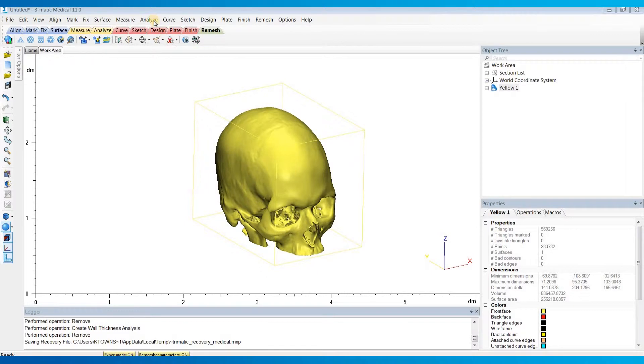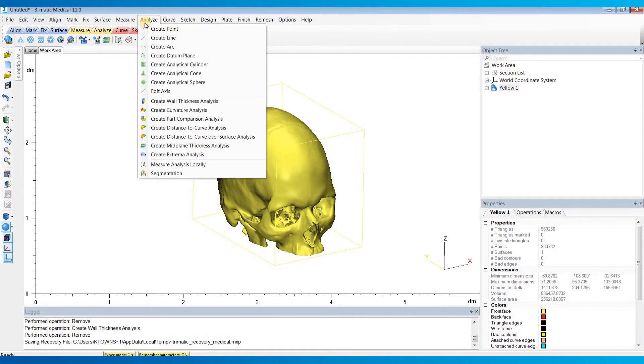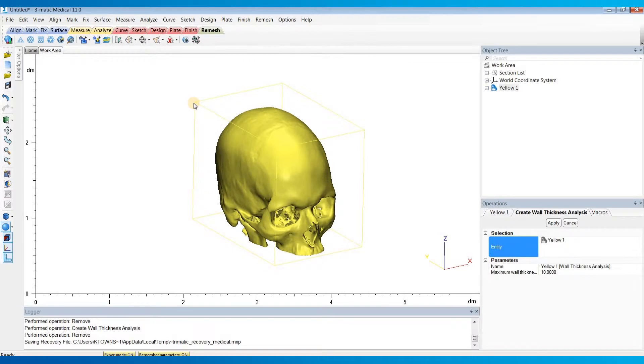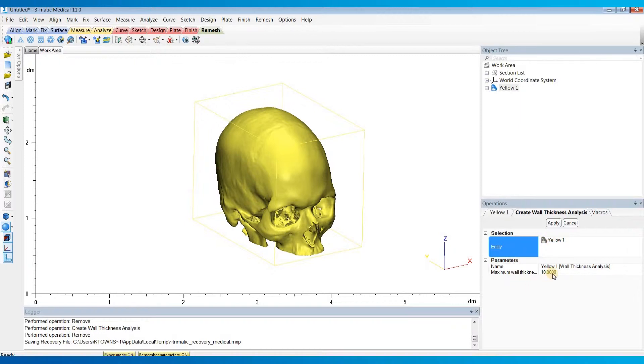So to start, I'll go to the Analyze menu and choose Create Wall Thickness Analysis. I'll make sure that the entity that I want to do the analysis on is in this field here, and then I'll set the maximum wall thickness for my analysis.